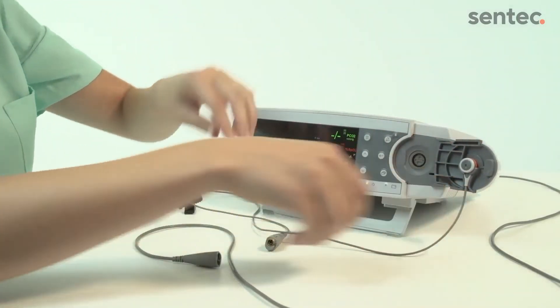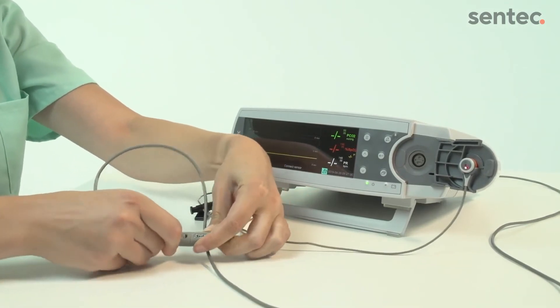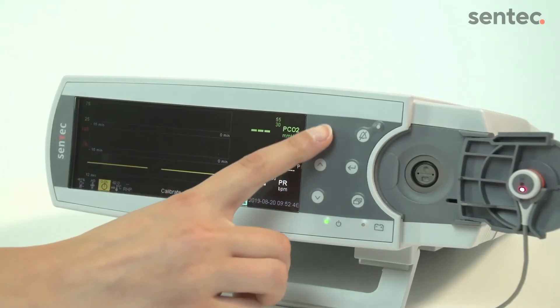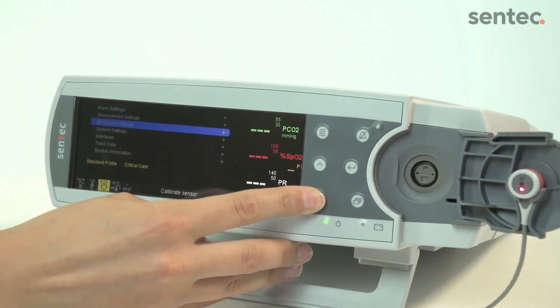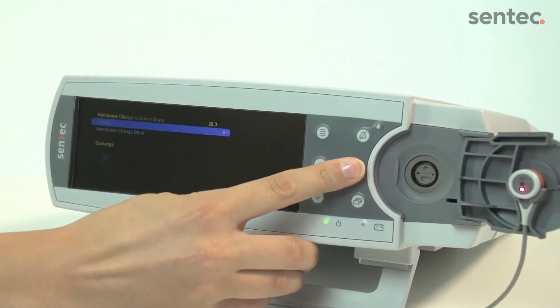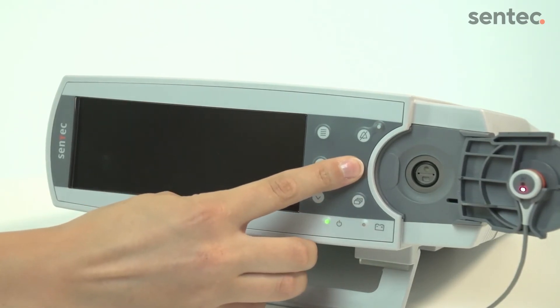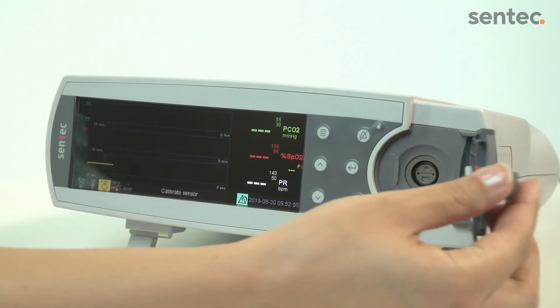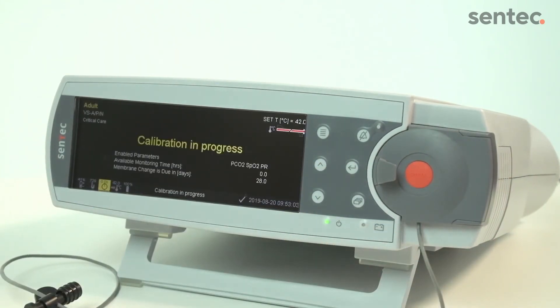Reconnect the sensor and confirm the membrane change on the monitor by selecting Membrane Change Done in the third menu option. Once the membrane change is complete, the sensor needs to calibrate. This calibration may take longer than usual.